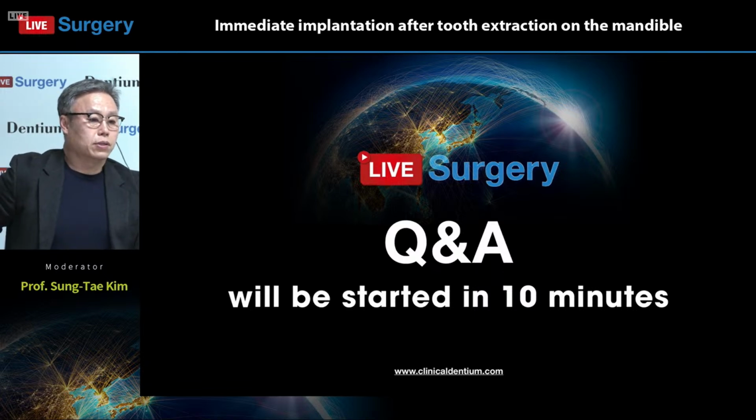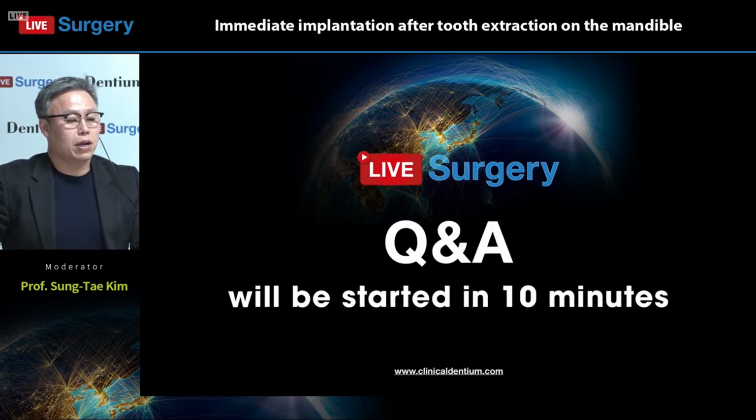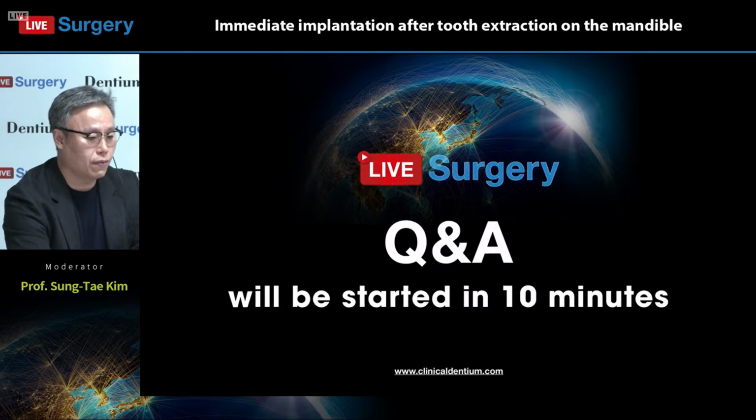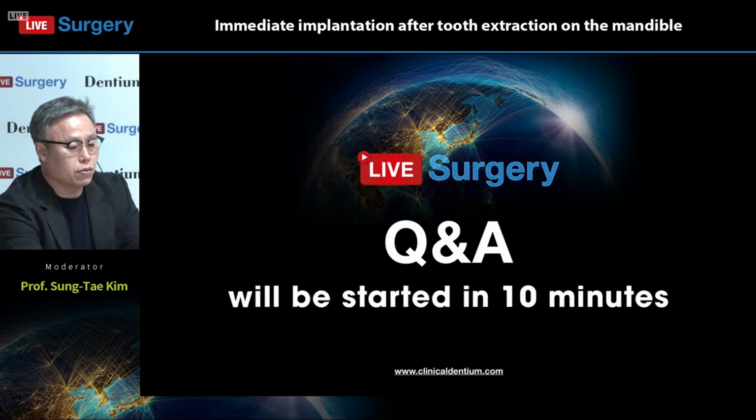So we're going to start the Q&A again after 10 minutes. Meantime, he's taking the radiograph after the surgery, so we can compare the panoramic radiographs before and after surgery. Yeah, we'll see you after 10 minutes.